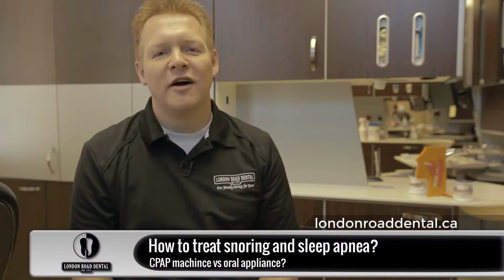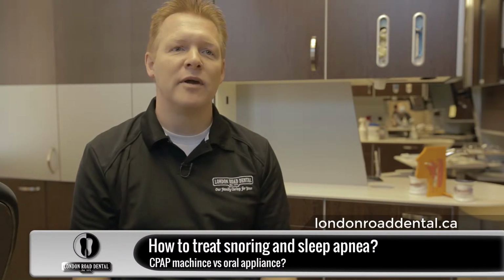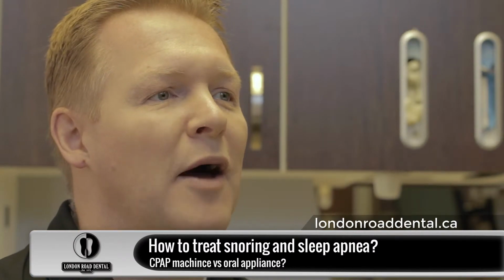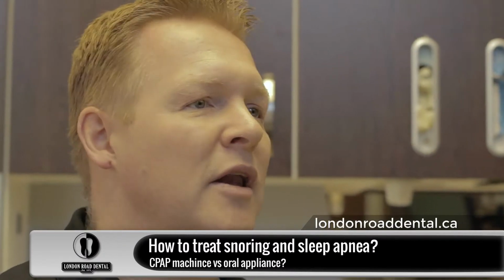Once a respirologist is able to diagnose and let you know if you have sleep apnea, there's really two essential ways to treat sleep apnea. One is with a CPAP machine. That's kind of been the gold standard over the many years of how to treat sleep apnea. They usually have some sort of a mask or nasal cannulas that go to your nose, and what it does is it just puts oxygen into your airway, and it kind of forces the oxygen. You're hooked up to a machine that pumps the air into your airway, keeping it open so that you can get the oxygen that you need. It's a very good way, and it's a sure way.